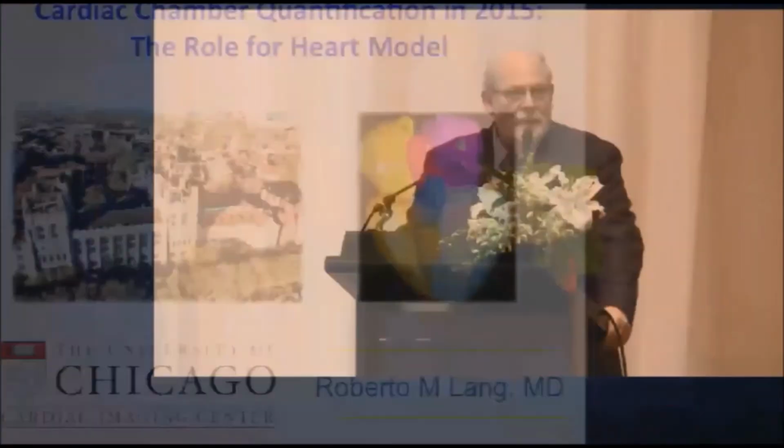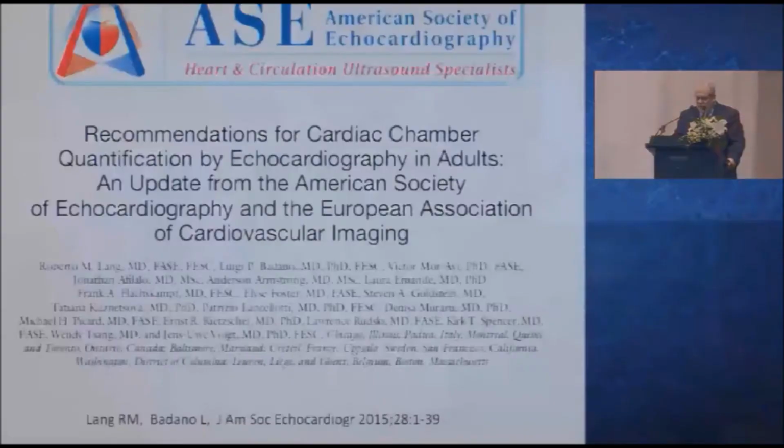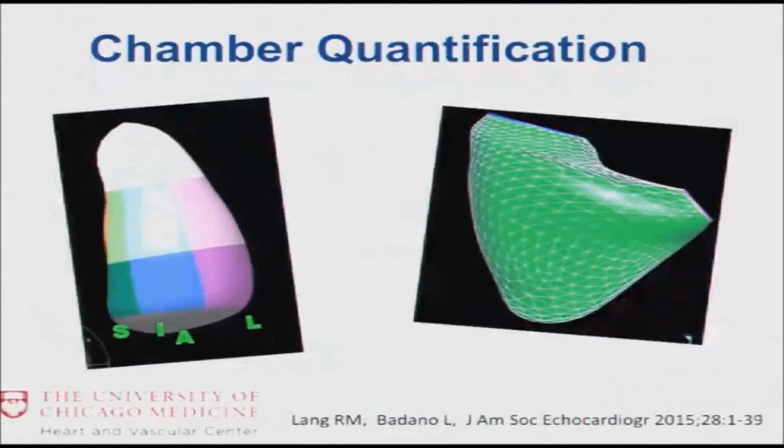Good afternoon. It is my pleasure to share with you our experiences with HeartModel, a piece of software that we have been working on for about 3 years. With the new recommendations for chamber quantification came, for the first time, the proposal that we should evaluate the left ventricle and the right ventricle using three-dimensional echocardiography.